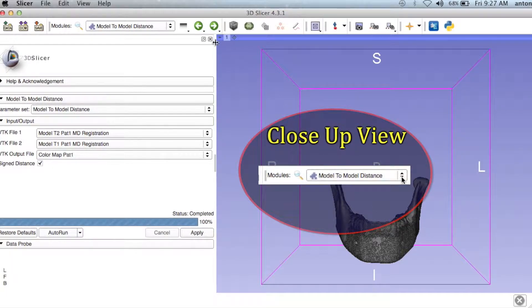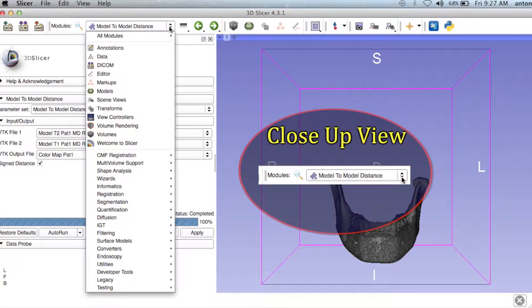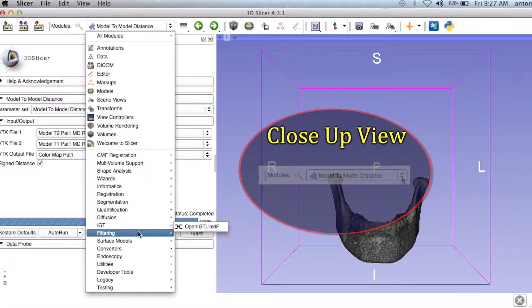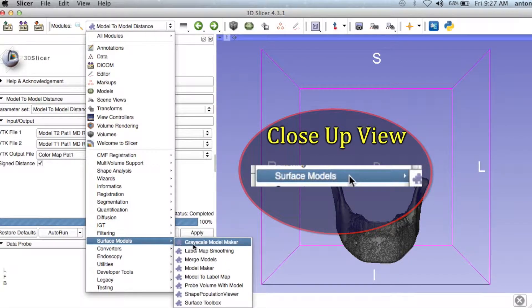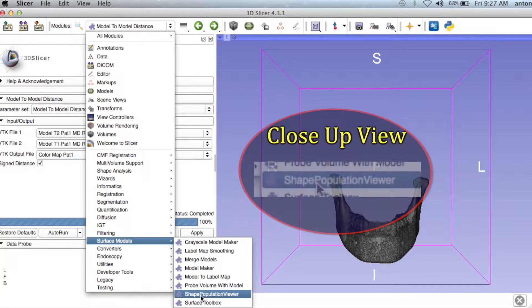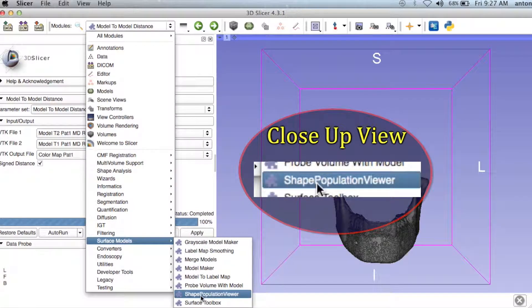After saving, go to the Modules drop-down menu, select Surface Models, then click the Shape Population Viewer module.